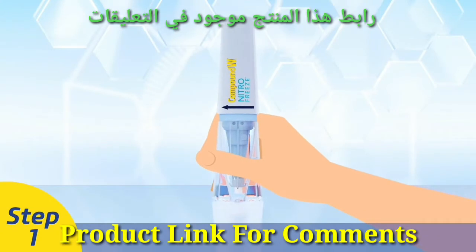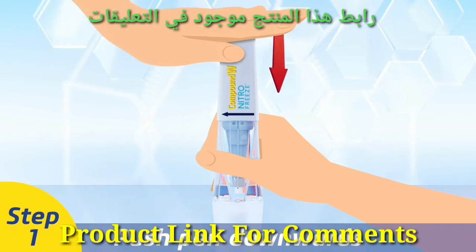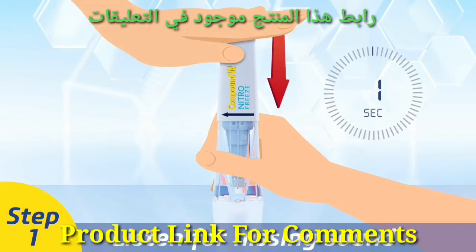Step 1. Place the pen on a table with the cap facing down. Push the pen downward continuously for just two seconds and listen for a hissing sound indicating activation.